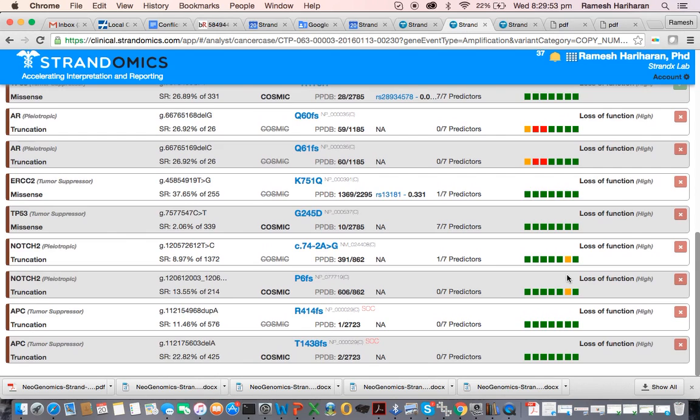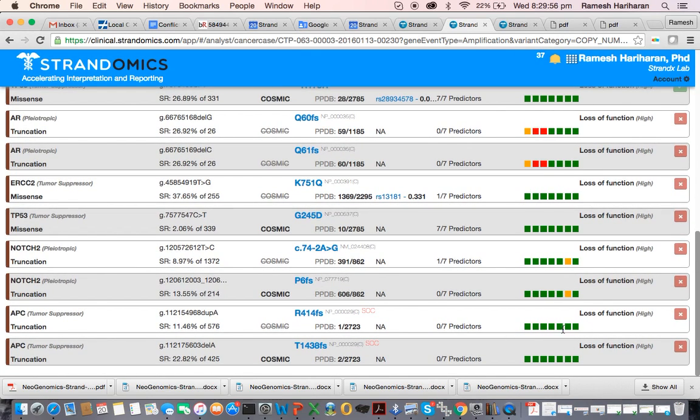So this is a relatively quick process, and some of the other things that are completely green, there might be other reasons to not report them, and those are mentioned here.